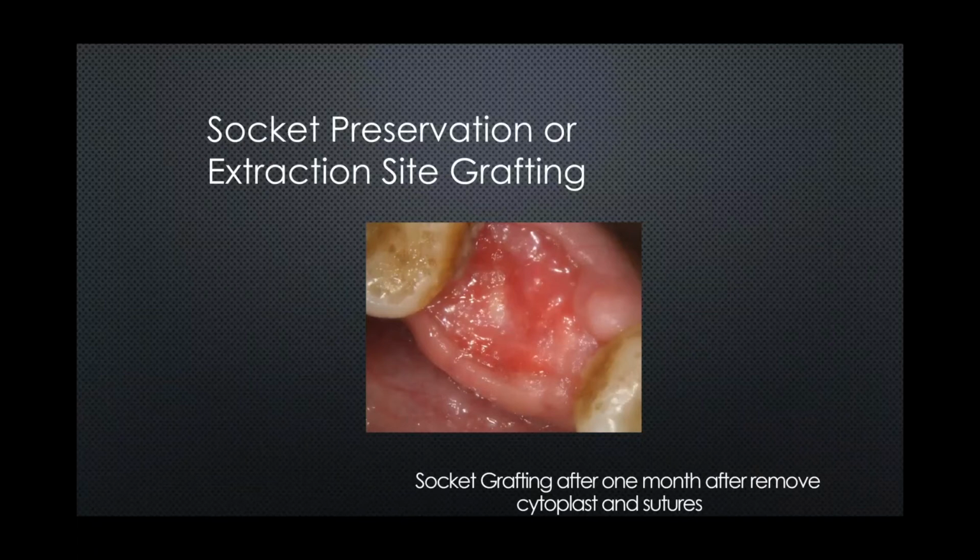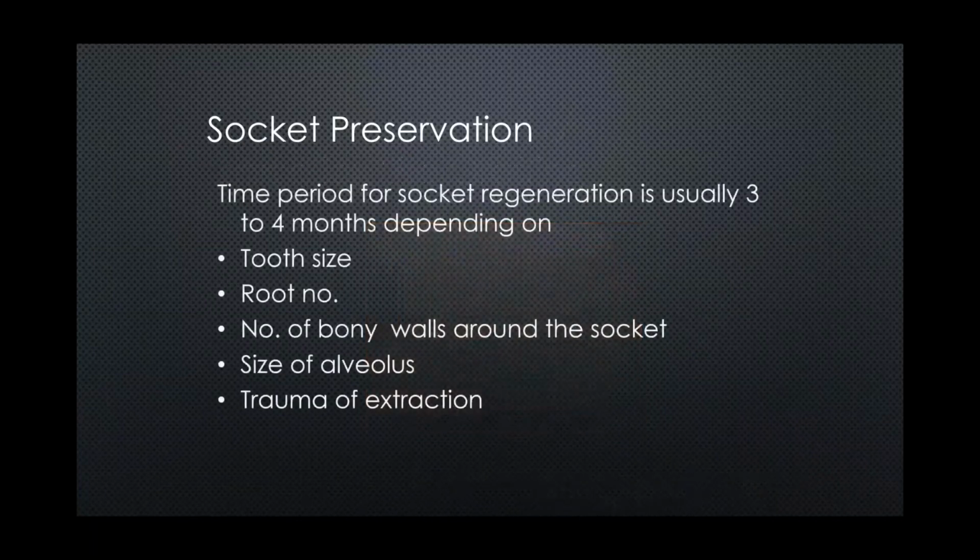But you can see that this whole thing is going to fill into a huge thick band of attached tissue. Very predictable horizontal bone growth, very predictable huge band of keratinized tissue in which we can place our implants. Set yourselves up for success. Okay, now socket preservation. How long do you wait until you place your implant?